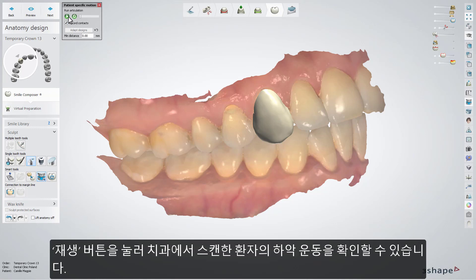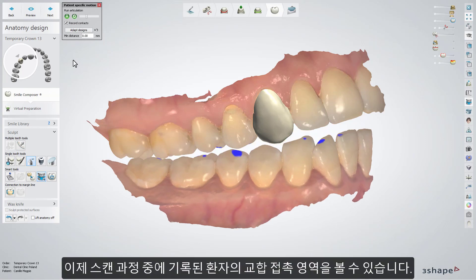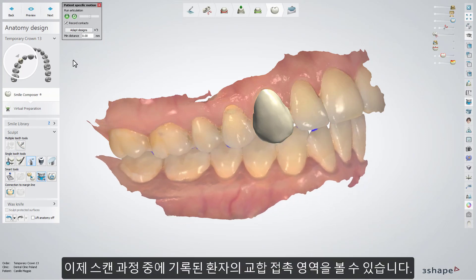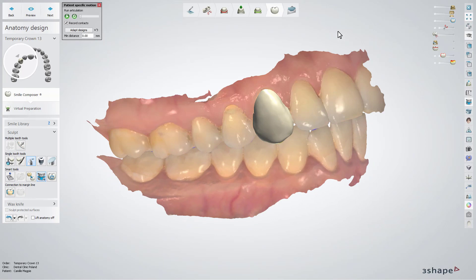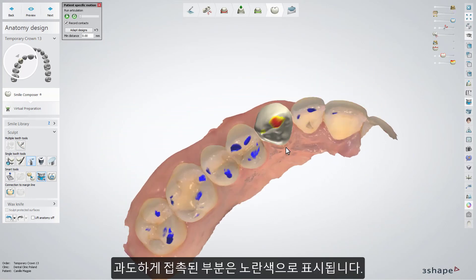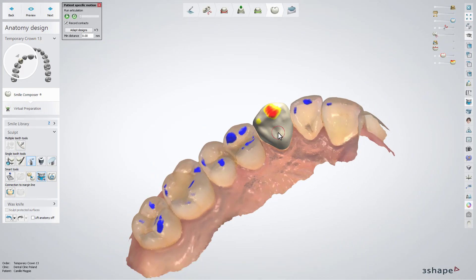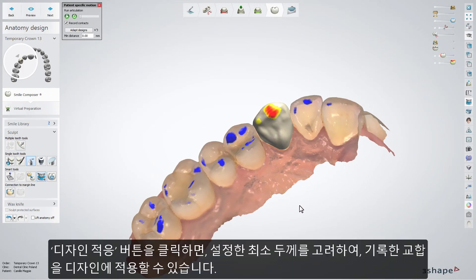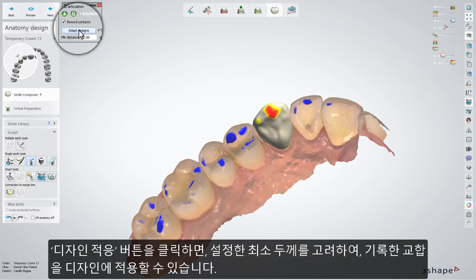See the movement of the jaws which was registered by the dentist. Now you can see the contact points that have been recorded during the scanning process. The hard contacts have been marked with a yellow color.